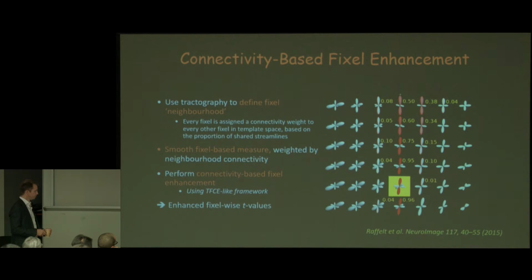What I would like to mention as well while I'm at it, because it's quite a neat trick. In the original TFCE framework, the method was geared at voxel-wise cluster enhancement on a voxel space. And the neighborhood was defined as those connected voxels, so those that are super threshold and connected to the cluster. In this framework here, the connection is defined by that connectivity matrix.